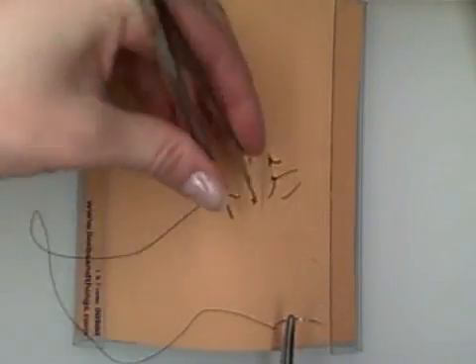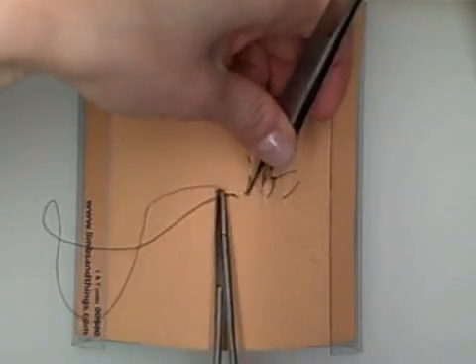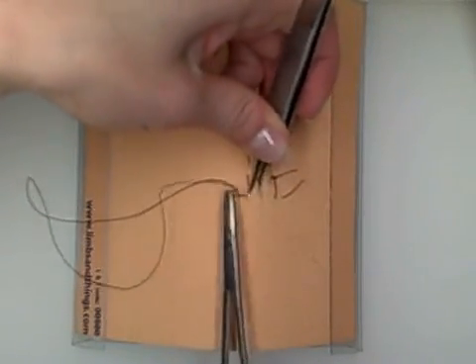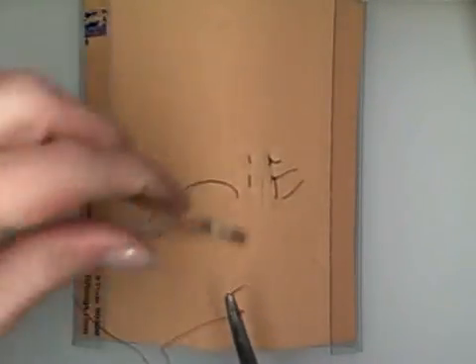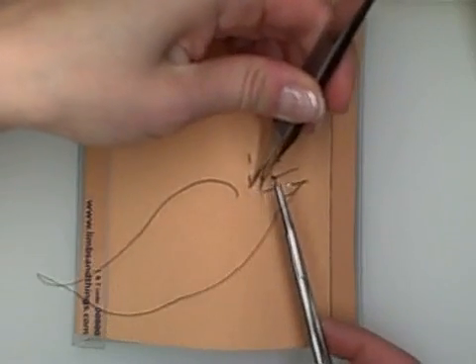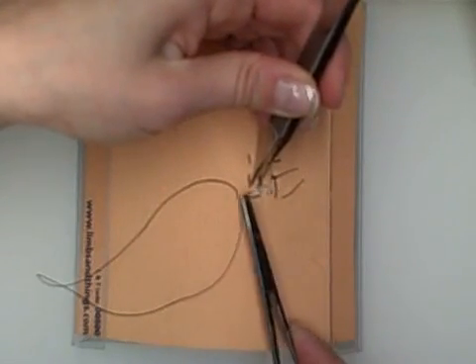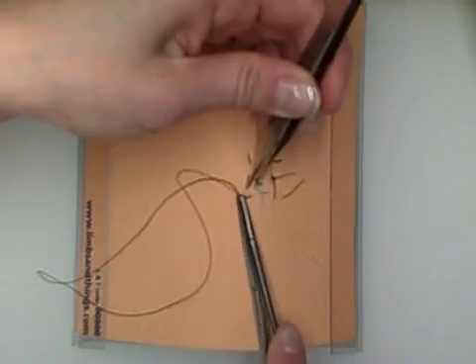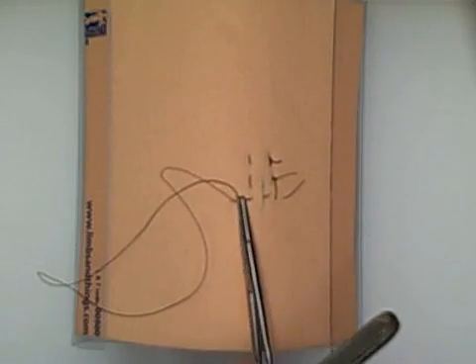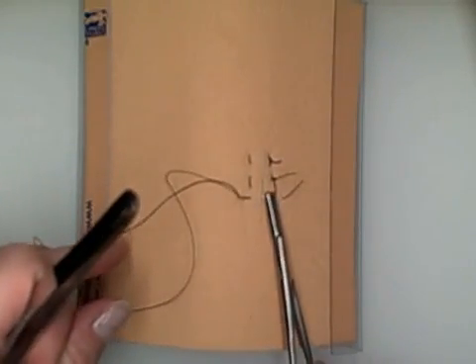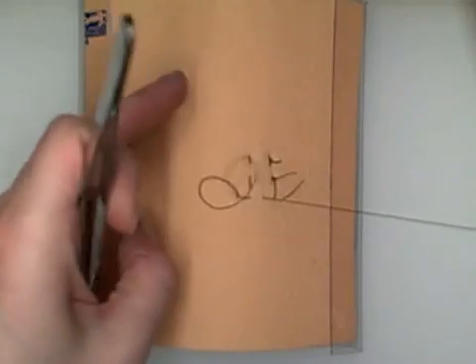So now we're going to turn the needle around and put it on backwards. And in that same line there, we are going to come in. And we're going to take a nice little shallow bite. So let's pull it through.